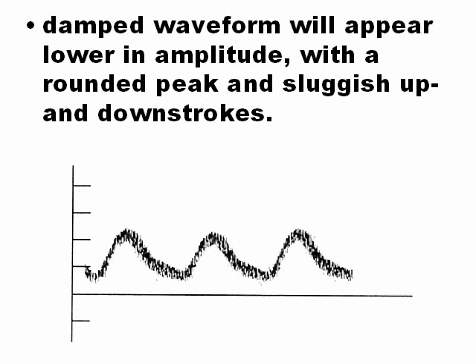But when there is stenosis, the triphasic wave becomes first biphasic, only positive and negative, and when there is more stenosis, the wave becomes monophasic like this, with no negative, only positive. This is the wave of a post-stenotic leg artery.